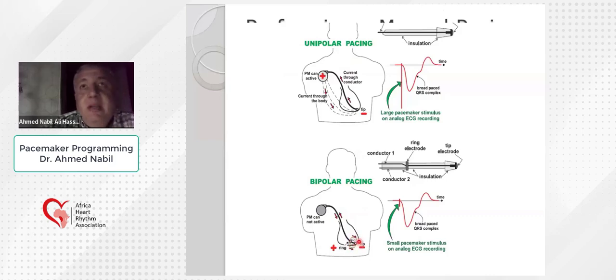But sometimes if we have high pacing thresholds in the bipolar pacing, we measure the pacing threshold in the unipolar pacing and compare which gives better values.